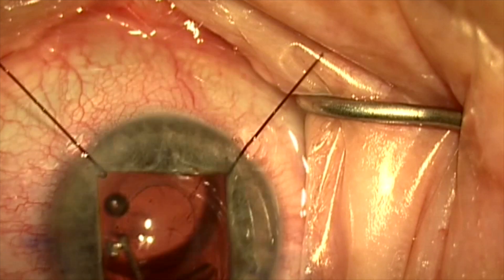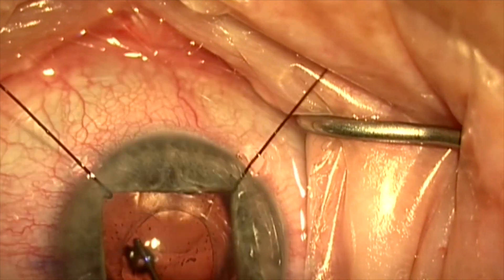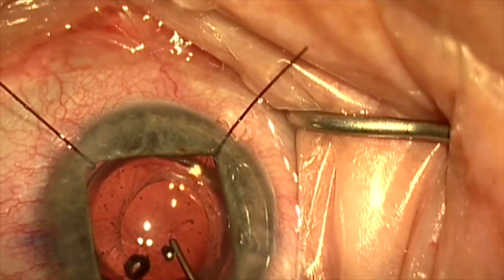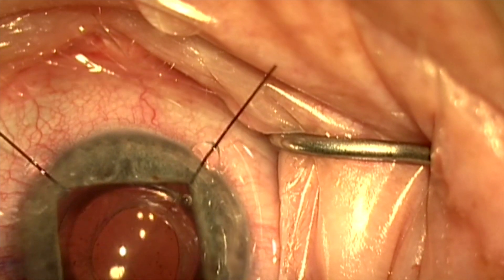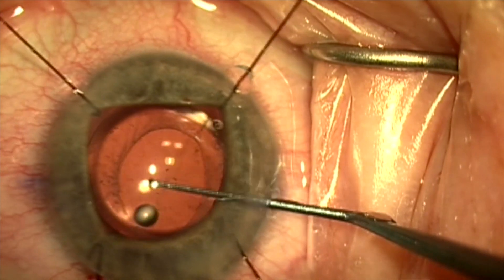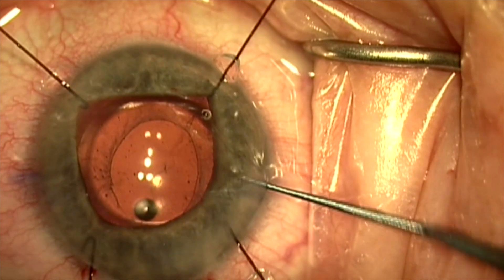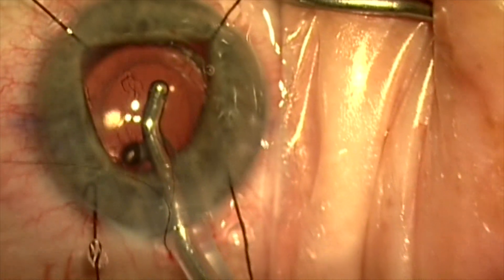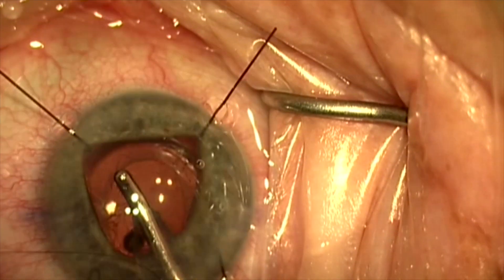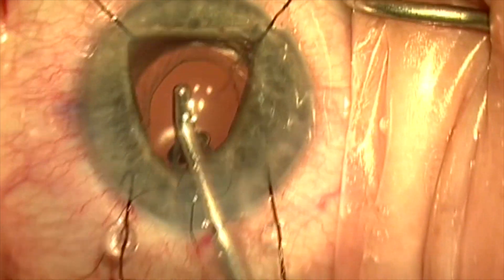We're going to inject the new lens into the capsular bag and rotate it into the correct position where the marks have previously been placed at 90 degrees. The lens centers very nicely and the haptics open up fully. We're going to remove the viscoelastic and test the support and stability of the lens, which is quite good.